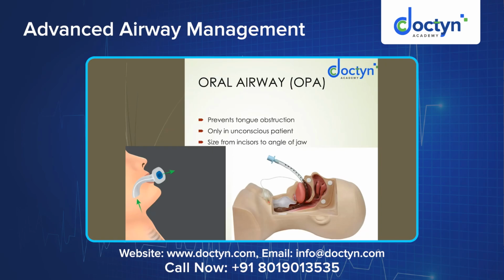There is a gadget called the oropharyngeal airway. On the left side, we can see this image. The oropharyngeal airway is a hard plastic airway which has a patent tubing inside. When you place this across the oral cavity, it reaches just posterior to the tongue and sits at the start of the oropharynx. Even if the tongue falls back, because this is hard plastic, it will not allow the tongue to fall and maintains a patent tubing, which leads to a patent airway, and your air gets across the vocal cords to the lungs.